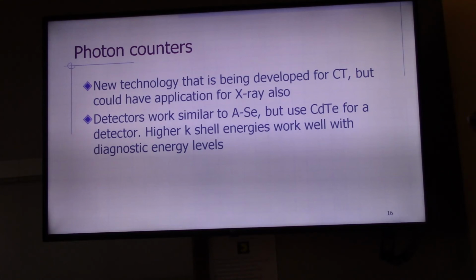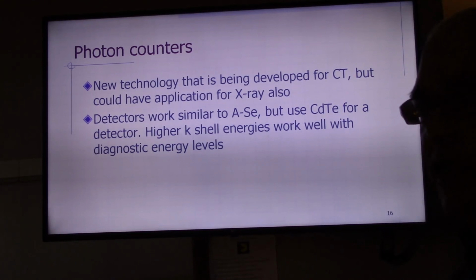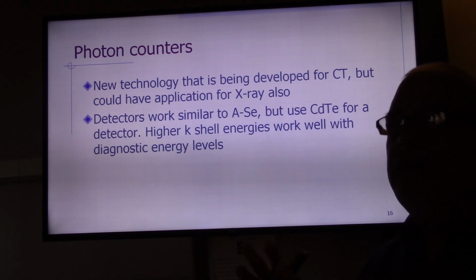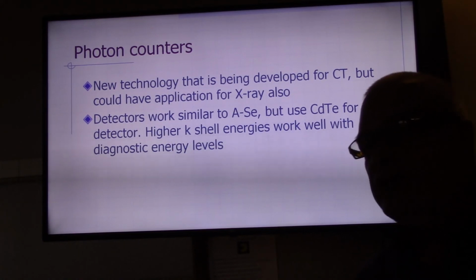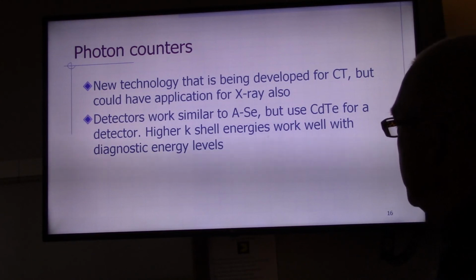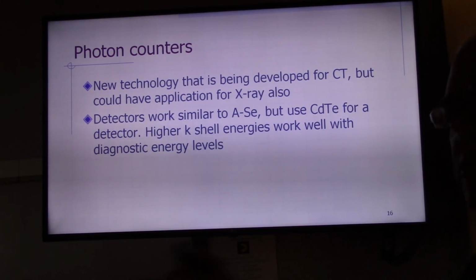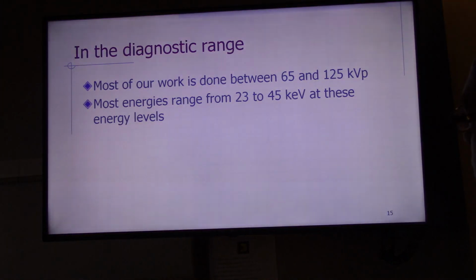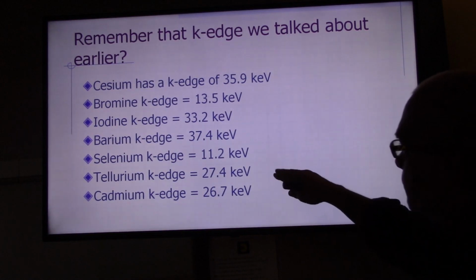Probably in the next few years, we're going to start seeing direct capture flat panel X-ray that uses the same technology. Right now, it is very, very expensive, and there's only a couple companies working on it. Siemens does. I think probably General Electric too, because where Siemens goes, GE soon follows, so it seems. So anyways, this is why for direct capture digital, we don't use it very much. As a matter of fact, we don't use it at all in diagnostic, and that is the reason why.